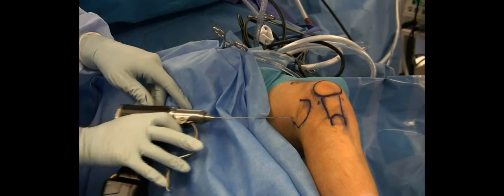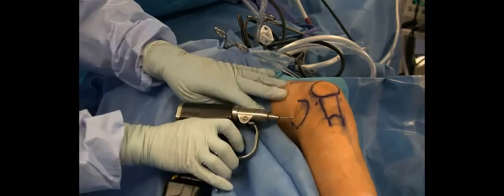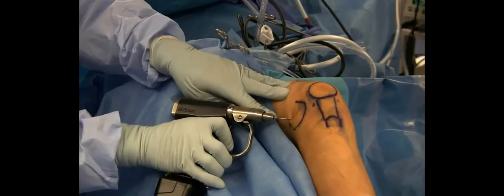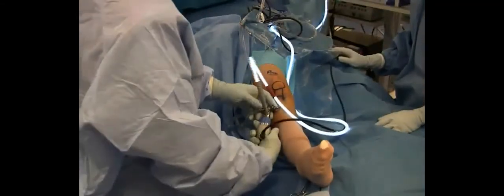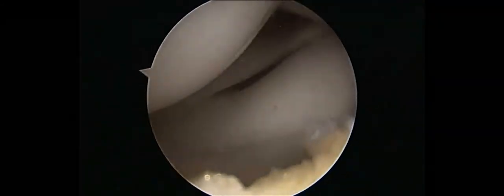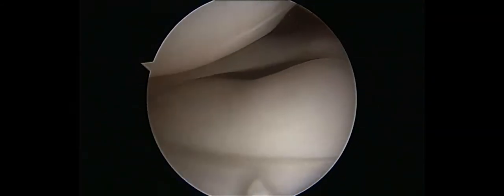At that point, the wires are pulled from the knee and the arthroscope is placed back into the joint. With the camera in the knee, we confirm that there is no significant violation of the articular surface. We also make sure that there are no unstable flaps or loose bodies.